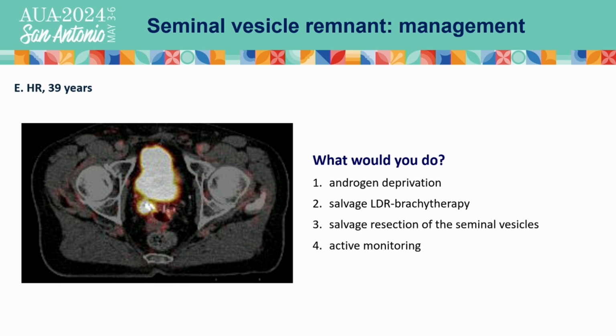Oh, I think you probably know what I would do. Sure. But I would consider it for seminal vesiculectomy, given his young age. Yep. And the other thing to think about for these is percutaneous ablation, depending on the closeness of the ureter. But I have referred some for some percutaneous cryo or something.